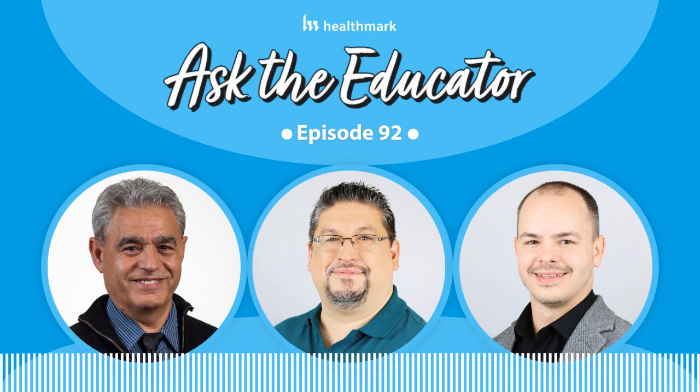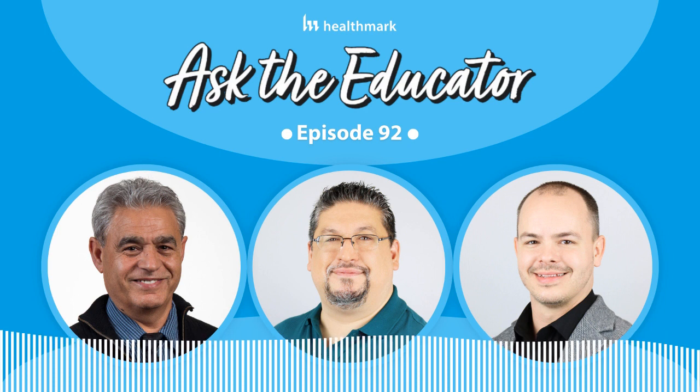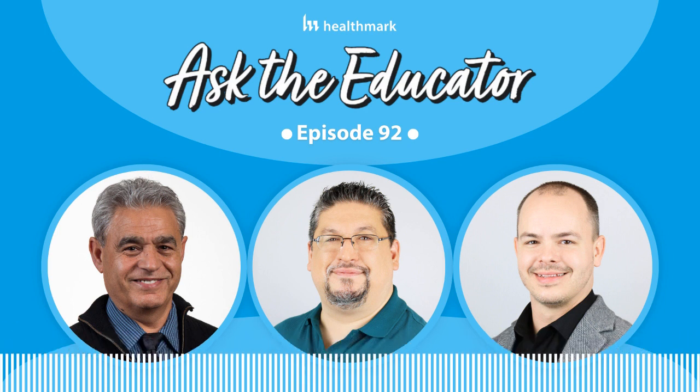Jahan, the next question really is, Adam talked about the standards and how they've been updated to explain that there is a need that we look at these cords and inspect them for damage. It's unfortunate, but the standard has been updated only after all of these reports and occurrences.